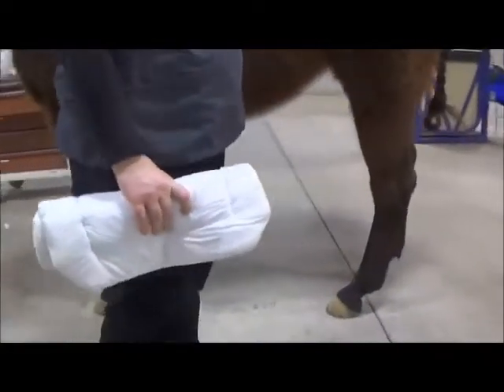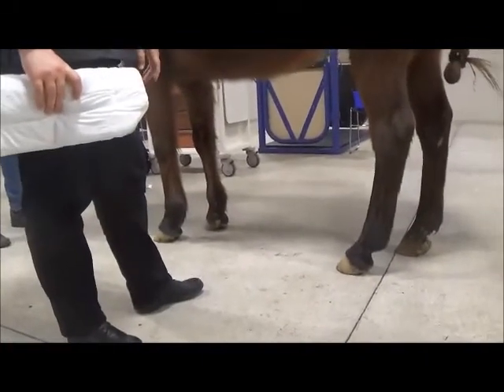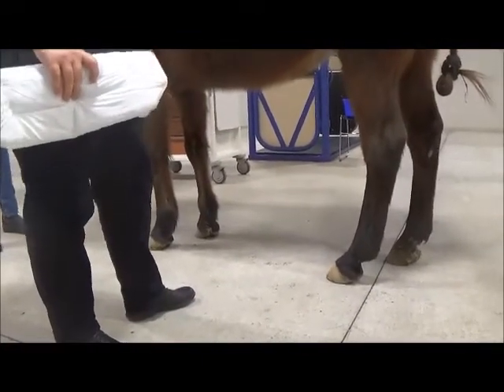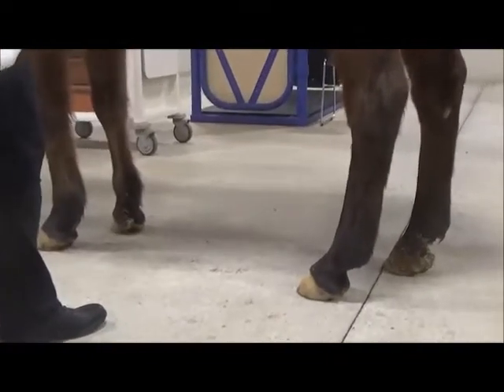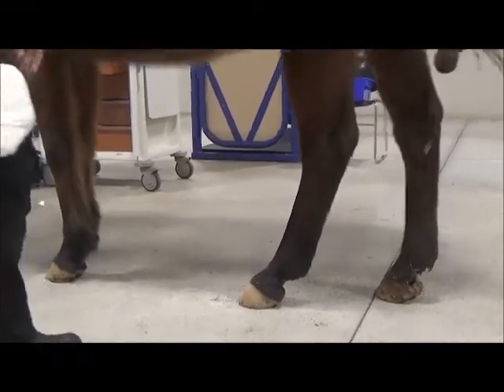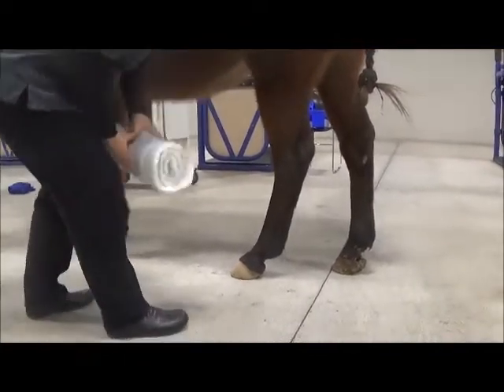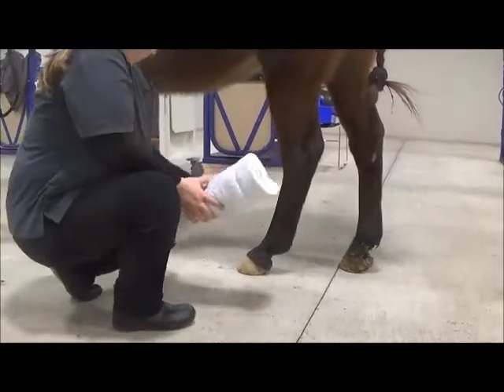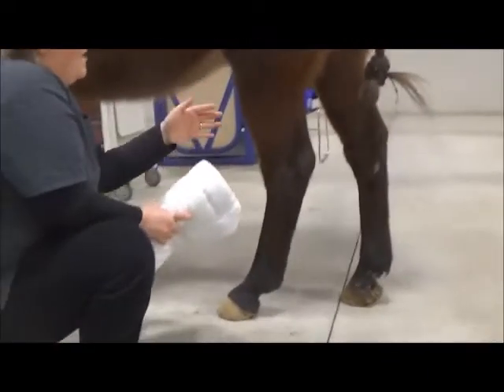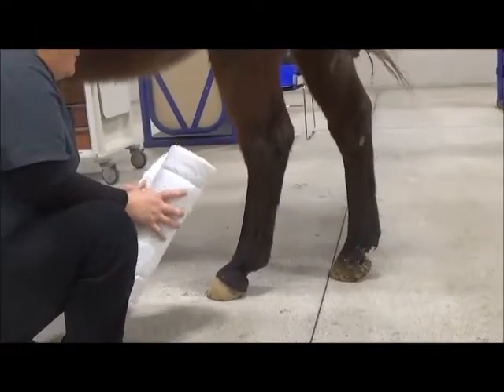Alright, so now I'm going to place a full limb hind limb bandage on Ruby. So this bandage ends up being multiple stacked bandages. You can make it as many layers as you want. I'm just going to do one layer today just to show you how to do it. But if I was putting a really extreme full limb hind limb splint on or something like that, then I would do probably 2 layers of this bandage.